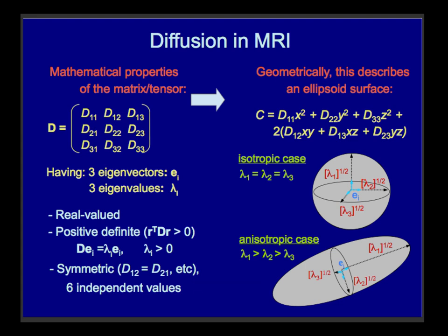And so these algebraic quantities correspond exactly to these geometric things of a sphere or pushing out a sphere into spheroids like a rugby ball. So when we picture them, this is mathematically equivalent. So we can deal with this geometrically and know that we have mathematics that we can use and quantify things with.